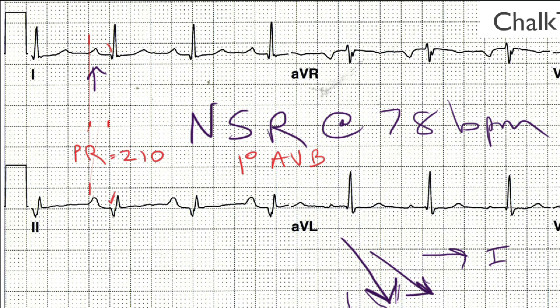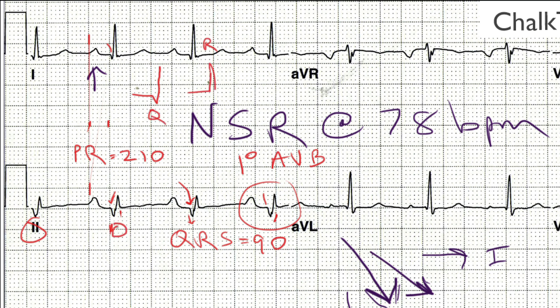Now, what about the width of the QRS complex? You can take advantage of the fact that this QRS complex ends on a heavy line and measure back to see that it's just above two small boxes — about 90 milliseconds wide, so that's normal. But while looking carefully at the QRS complexes, in lead two the initial deflection seems to go down. If the first part of the QRS goes down, we refer to that as a Q wave — and this definitely looks like a Q wave. It's more than one box wide, so that's abnormal.